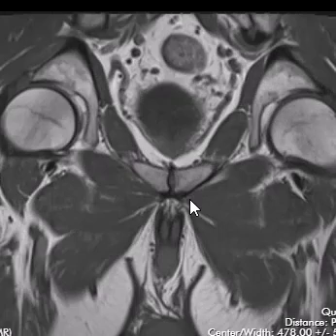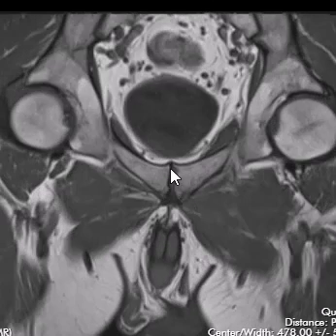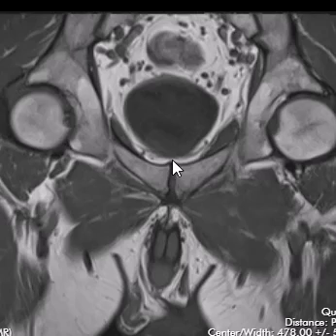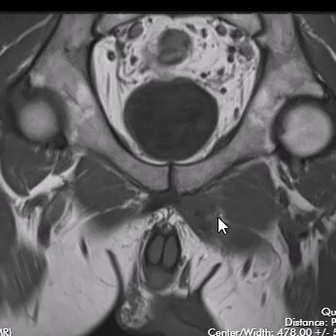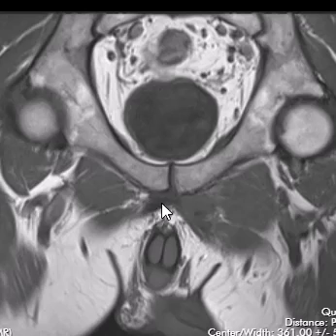On this case, going to the very back, things are good. At the midline cut we can see that the symphysis pubis looks very good — there are no marrow changes. Moving towards the front, we do see an abnormality along the under surface. On the right-hand side it looks normal, with a little dark area here.